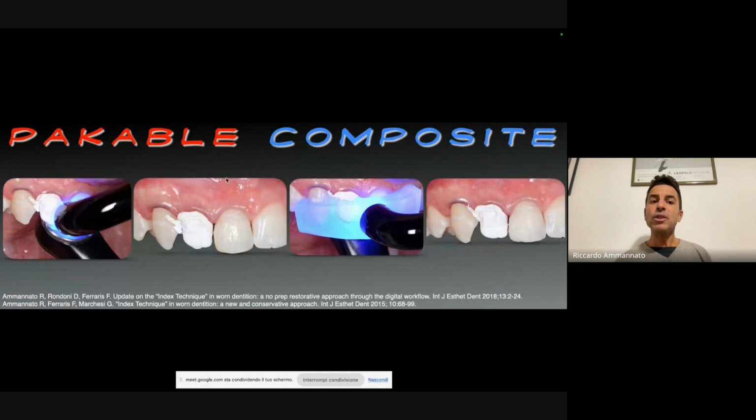Now, I'm using a packable composite, heated up packable composite. So it's a variation, let's say, of the flow injection. When I don't drill the holes, I also use the flowable one in these kinds of cases, but without drilling, I just place it on the tooth, and then I will land with the index, because in my hands, I have fewer bubbles.